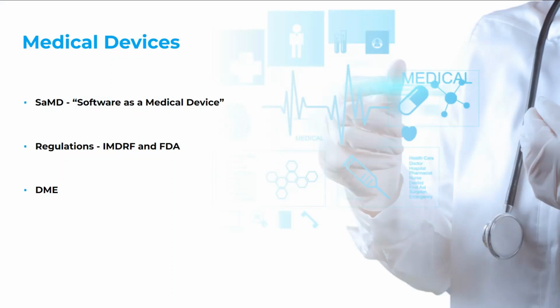So to start, what is a medical device, what is medical device software, and what is software as a medical device, which is a newer term that's been gaining popularity, and you'll see it written out like this, SaMD. A medical device can range from a simple tongue depressor, even bedpans in the hospital, to something more complex like an implantable pacemaker. Things like that are also medical devices.